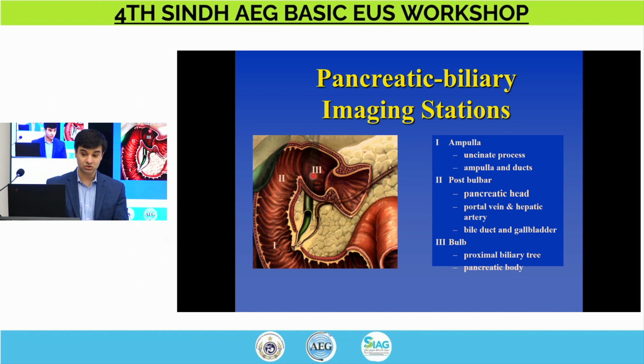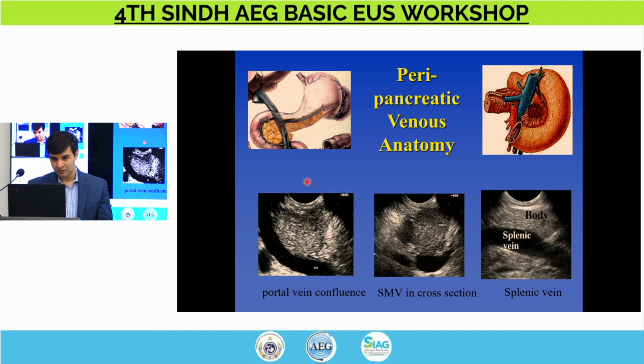Okay, so you want to ideally get into the part where the bile duct is just about entering the pancreas. So there's a suprapancreatic portion of the bile duct, there's an intrapancreatic portion of the bile duct, and that junction is where you have about 1 or 2 centimeters of peritoneal cover. And so that is the most ideal area to intervene when you want to, let's say, do something that is therapeutic with the bile duct.